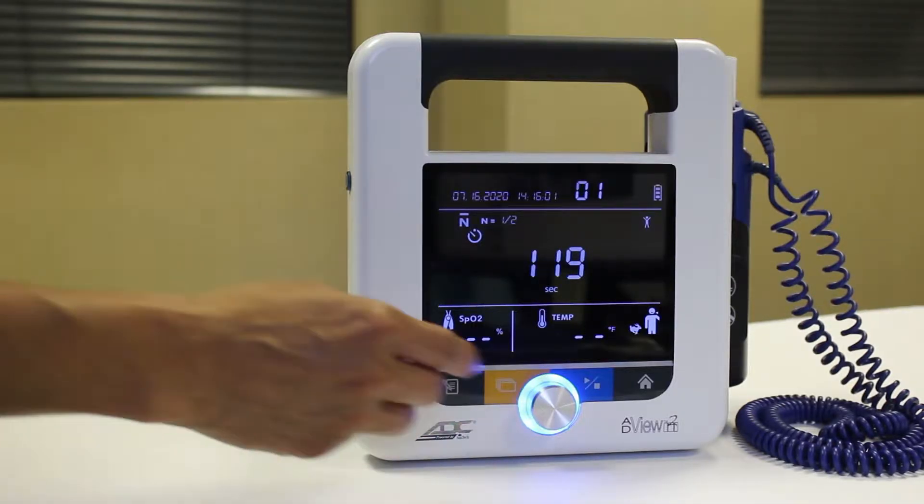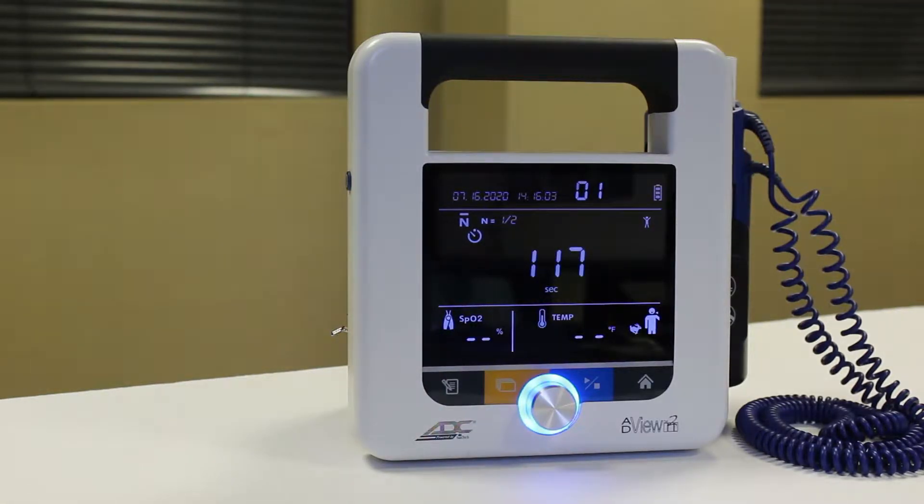Once you confirm the last setting, measurements will begin automatically. If you've set a first measurement delay, the countdown timer will initiate. If no delay was selected, the cuff will start to inflate.